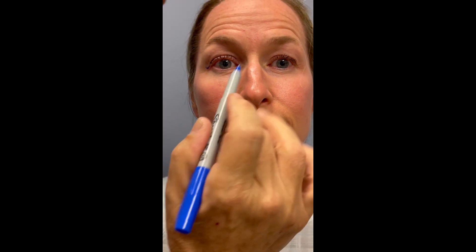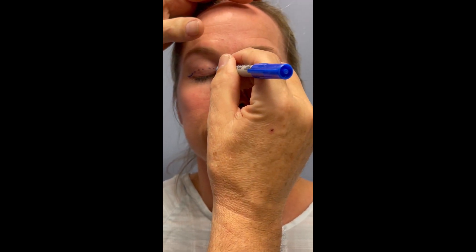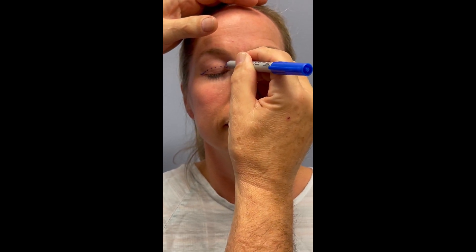We ask our patient to gently open their eyes, and then we go all the way to the end of the fullness — what we call the deformity — and we note where the punctum is. We don't want to extend our incision past that.